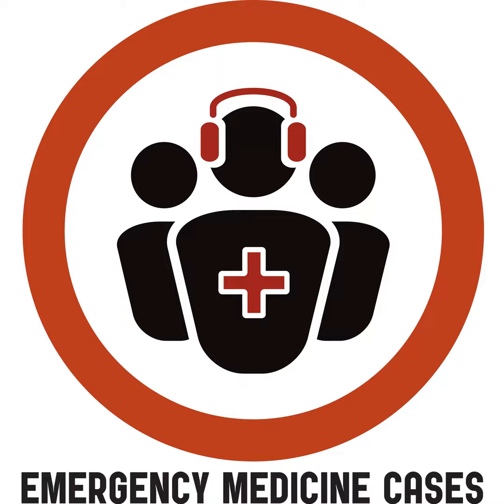I want to move on from CT scans to ultrasounds. Now, we have talked about MSK ultrasounds in the past on EM Cases. Dr. Sayal, when we did our shoulder episode, and the lovely Dr. Dale Dancer, who's an orthopedic surgeon who also works at North York, was on that episode. And when I asked him who needs an MSK ultrasound in the emergency department for the shoulder, he very clearly and plainly said 0. Because in his opinion, ordering an ultrasound of the shoulder from the emergency department, if anything, can just mislead clinicians to either falsely reassure them that everything is fine or actually come up with potential injuries that actually aren't even there.